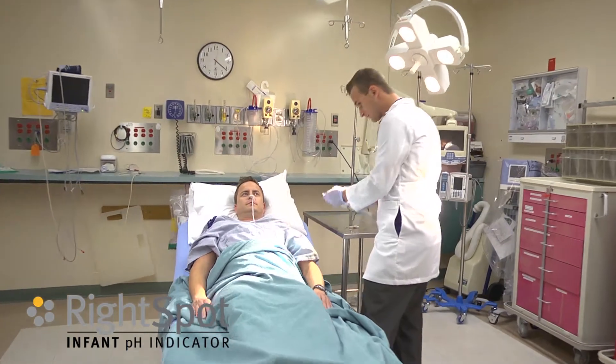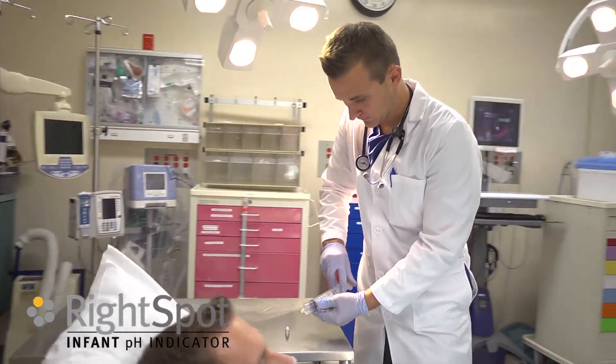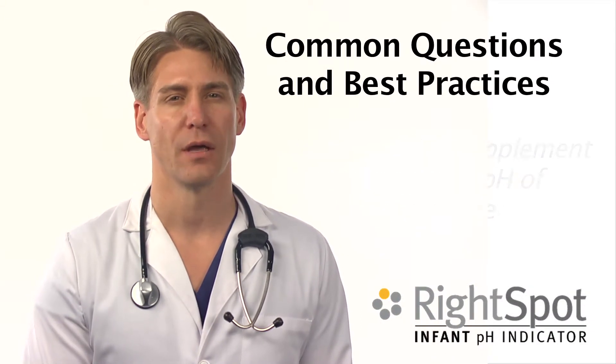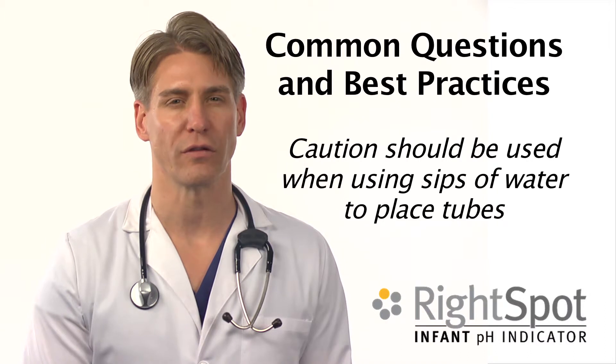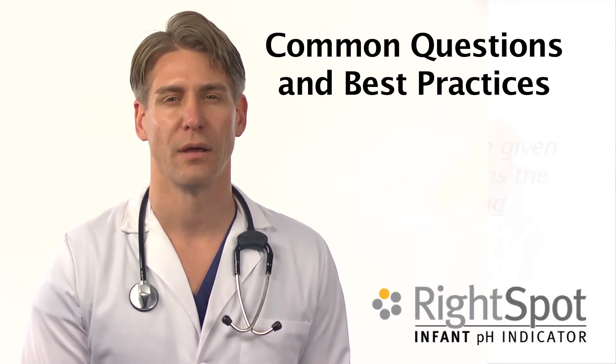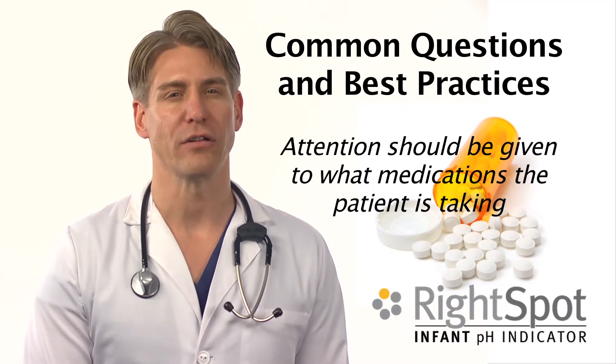Interpretation of the test should not be done by one who is color blind. This test is designed to be used by qualified medical personnel as an aide in professional diagnosis. Water or feeding supplement may change the reading. Caution should be used when using sips of water to place tubes in conscious adults.